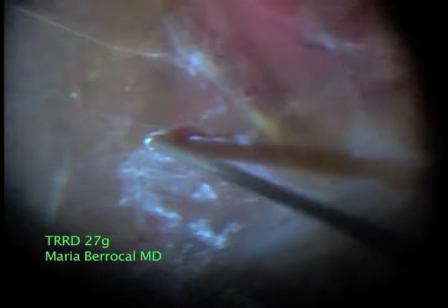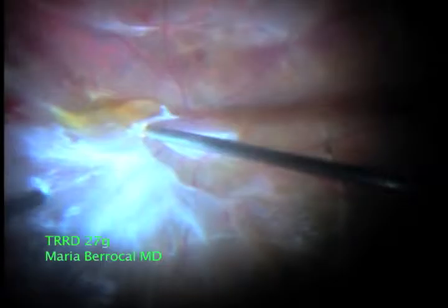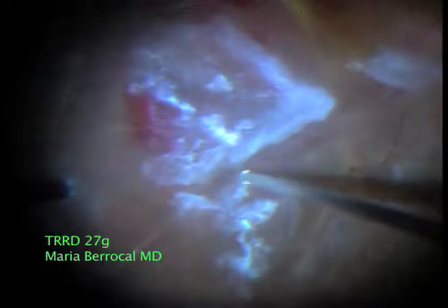As you can see, the probe is being used almost as a lawn mower. The area adjacent to the optic nerve is usually an area where there is a potential space, and we are lifting at the same time as we are cutting to basically dissect all of the tissue.